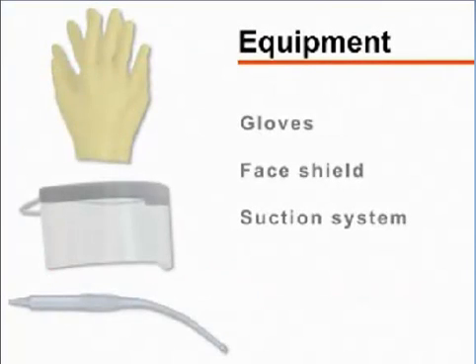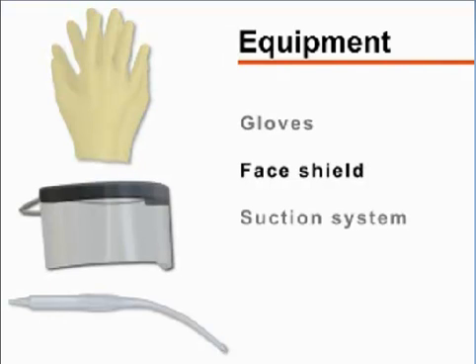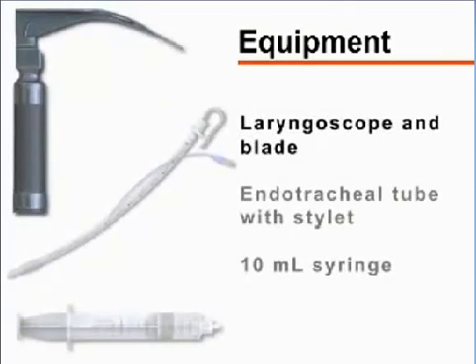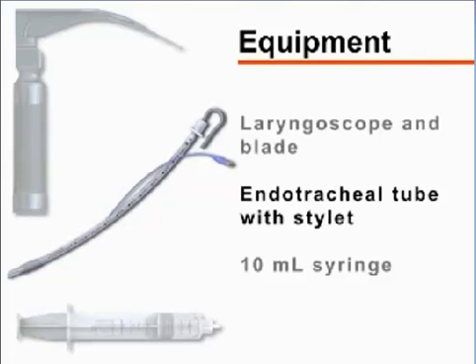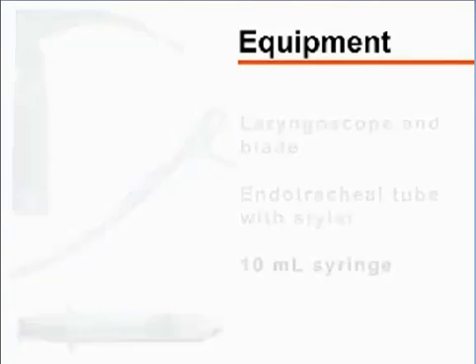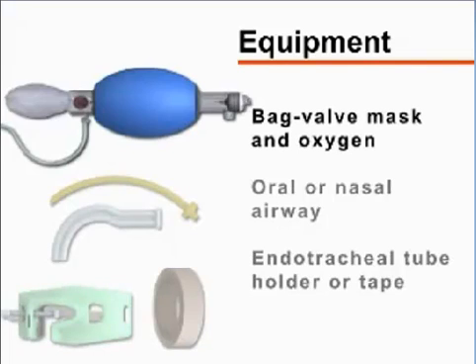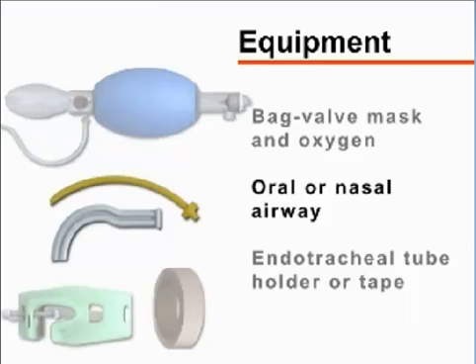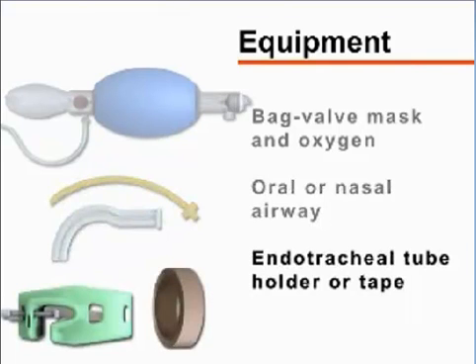Begin by gathering the required equipment. You will need gloves, a protective face shield, and a working suction system, a laryngoscope with appropriate blade, an endotracheal tube with stylet, and a 10 milliliter syringe. You will also need a bag valve mask attached to oxygen, an oral or nasal airway, and tape or an endotracheal tube holder.